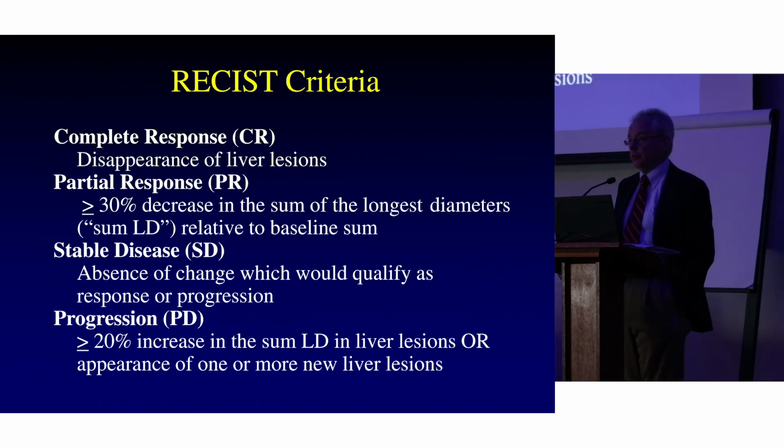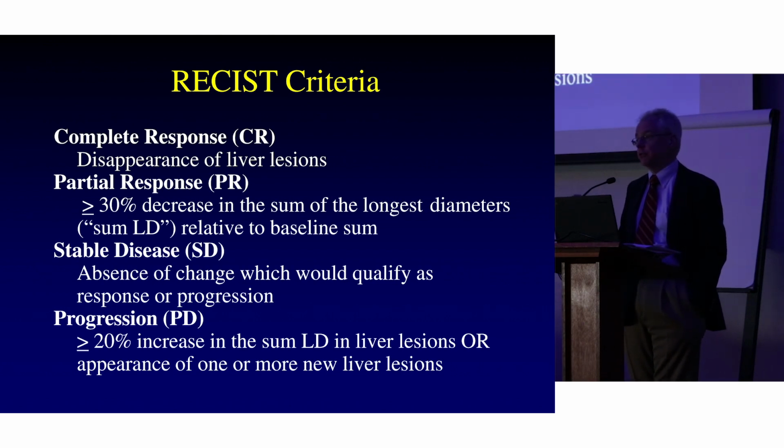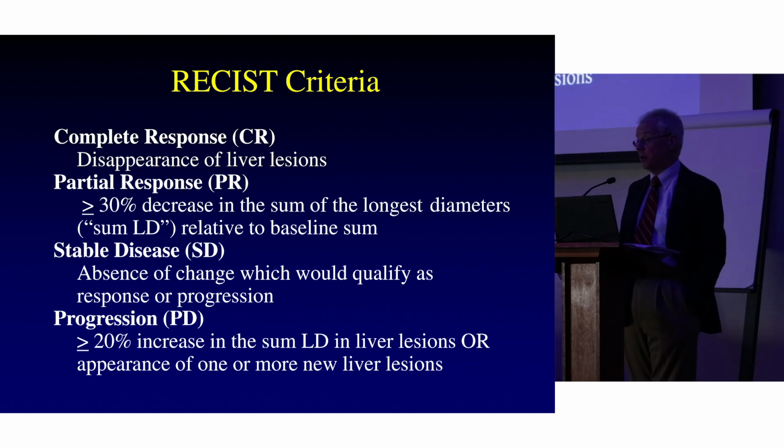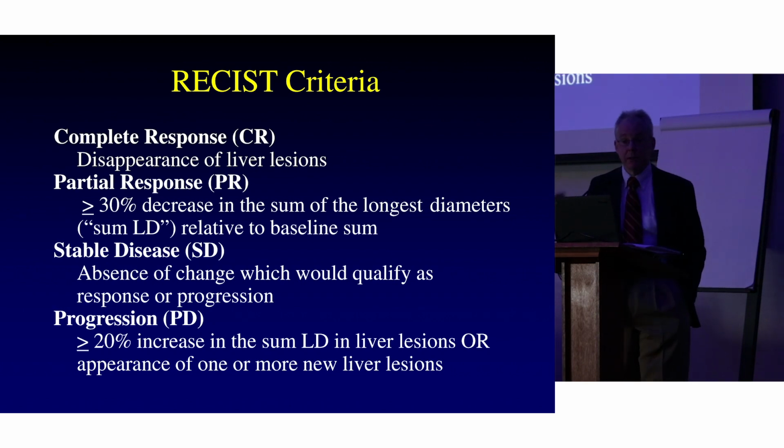Venturing into the world of looking at images from research, to help guide research studies. This is a simplified version, but I wanted to include this because you may hear some of these terms in the next hour, and I wanted to make sure you know what they mean.